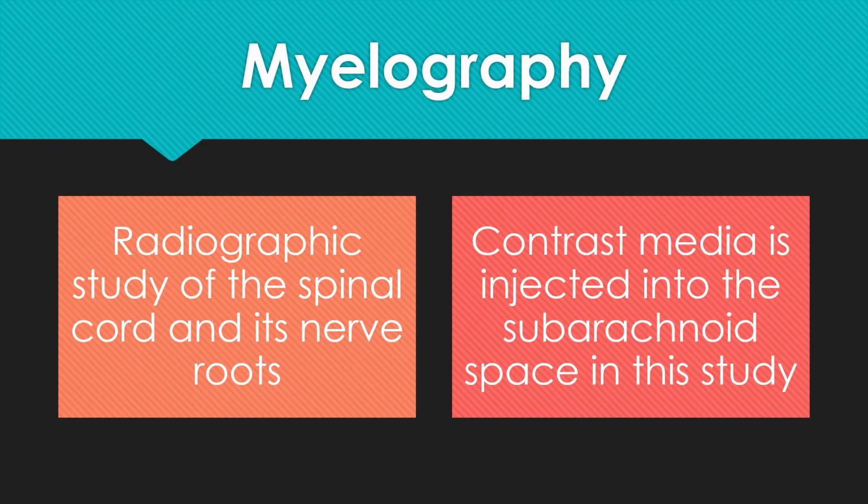The water-soluble contrast is used for CT and regular arthrograms, and myelograms will be used with gadolinium if we're going to do an MRI.